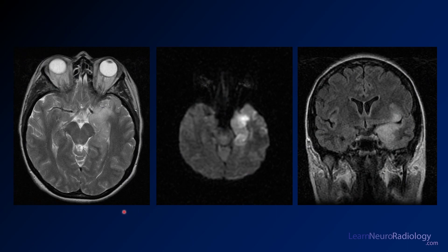On the MRI, the medial temporal lobe shows a lot of T2 hyperintense swelling — much more obvious on T2 compared to the CT. On diffusion, it's very bright, involving the amygdala, hippocampus, and medial temporal lobe, with maybe a little extension up into the insula. On the coronal FLAIR, we see swelling and loss of gray-white differentiation.